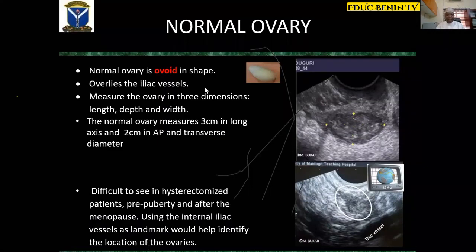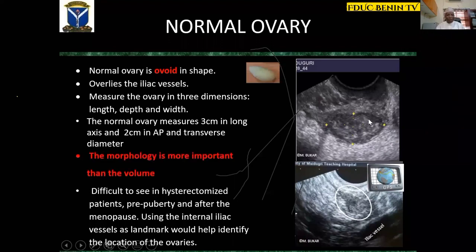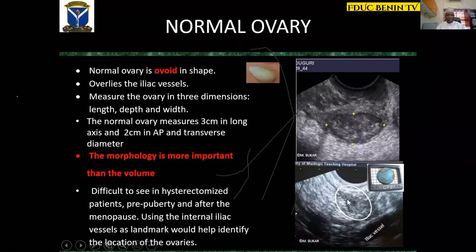The normal ovary is ovoid in shape. What is important to emphasize is that the morphology of the ovary is more important than its volume. The volume on day 3 of the cycle will not be the same as on day 14. During prepubertal years and the postmenopausal period, it may be difficult to identify the ovaries — what makes them easily identifiable are the follicles. In women who have had hysterectomy, it may be difficult to identify ovaries, so I locate the iliac vessels — once you locate them, the ovary overlies them. The iliac vessel serves as a GPS to locate the ovary in difficult cases.